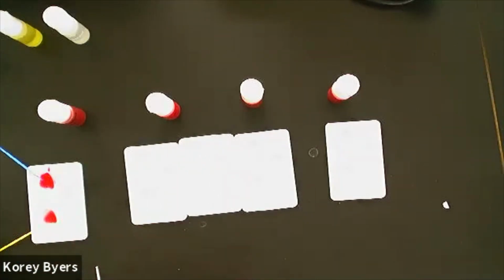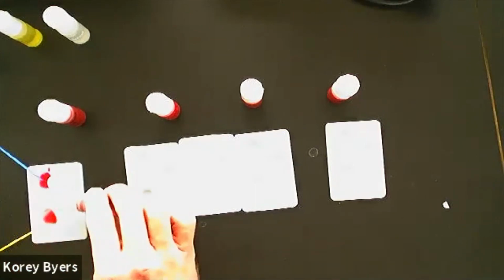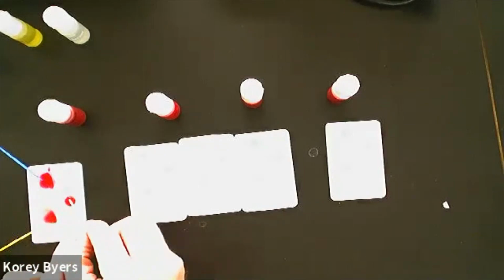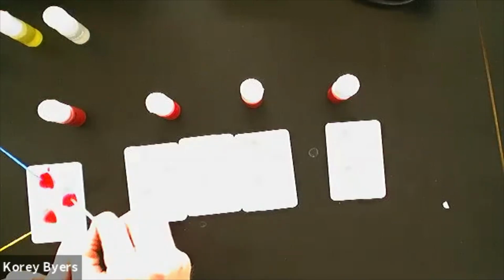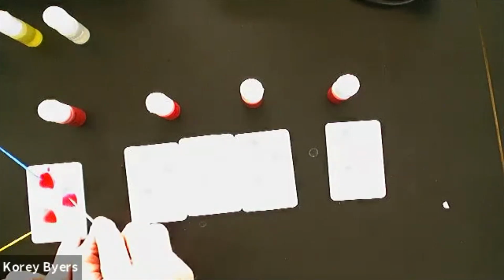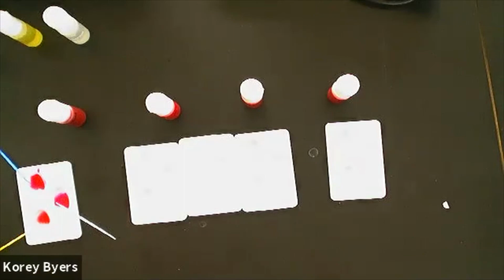Now to figure out if she's positive or not, we do the same exact thing. Just take the drop of blood and put it on the positive, or on the RH, I'm sorry. Take your white toothpick and stir, and not a lot's happening. Some of these need stirred for about 15 seconds, but nothing is happening. So we can say no on type RH.